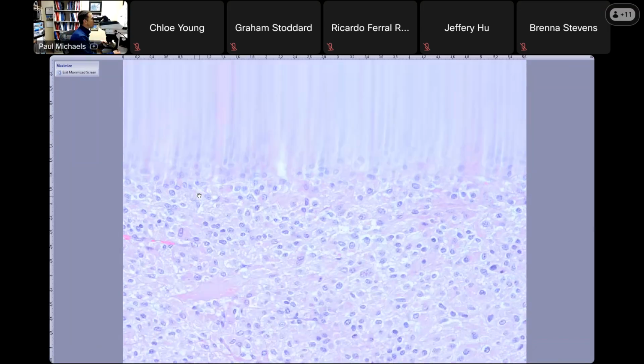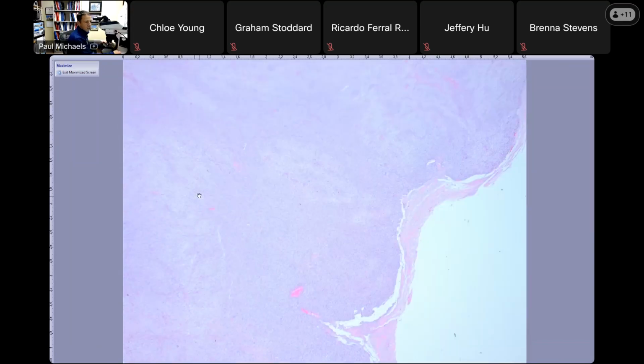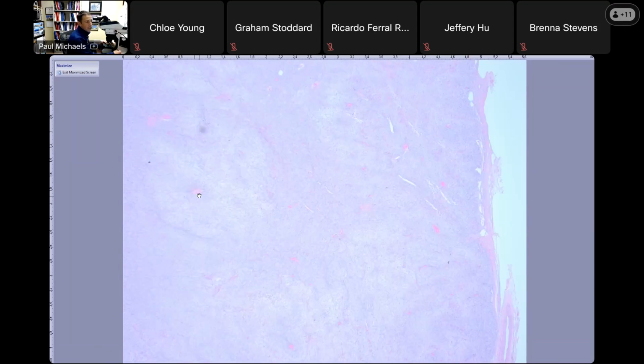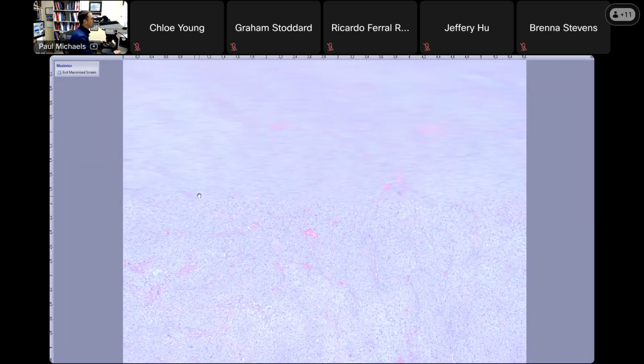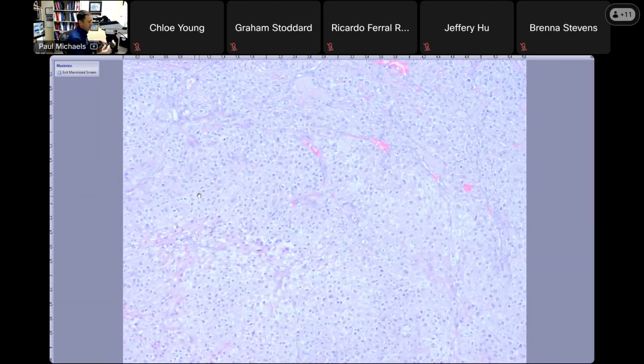So this one has necrosis. If you look at the periphery, it doesn't really have capsular invasion. There wasn't vascular invasion. There are not many clear cells, so that would get a score. There was necrosis, and there were actually quite a few mitoses when you counted per 50 high power fields or 10 square millimeters. So that was an adrenal cortical carcinoma.